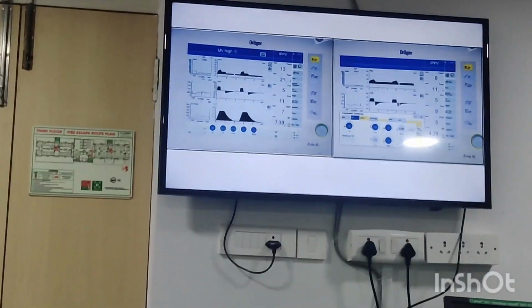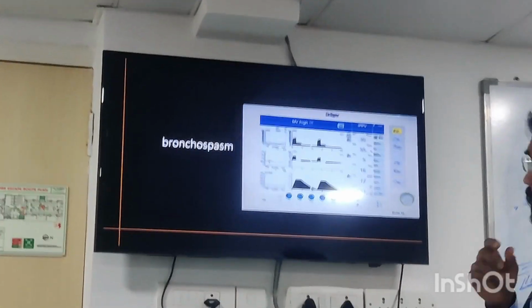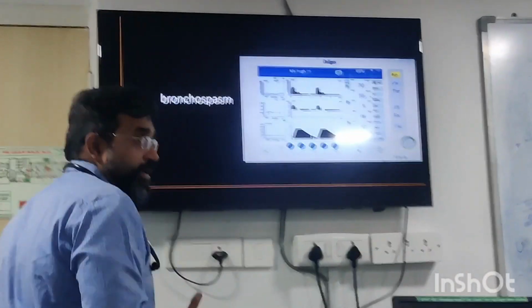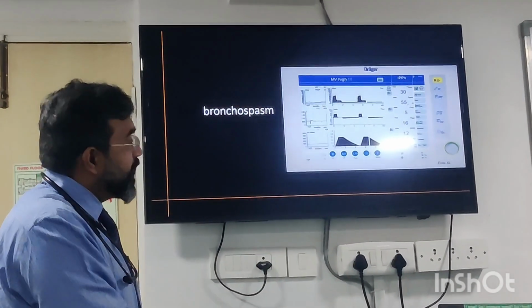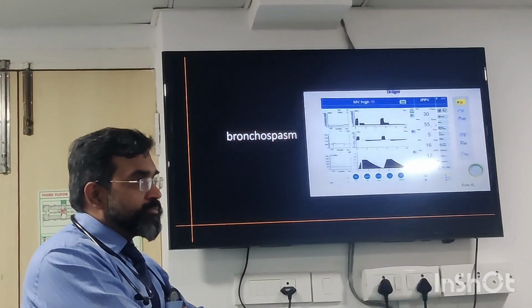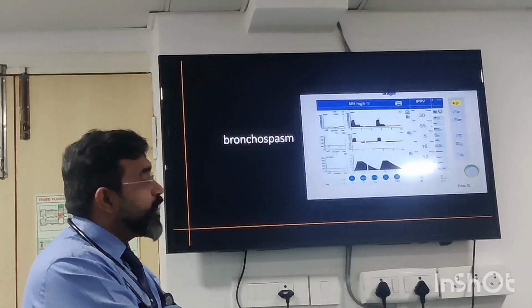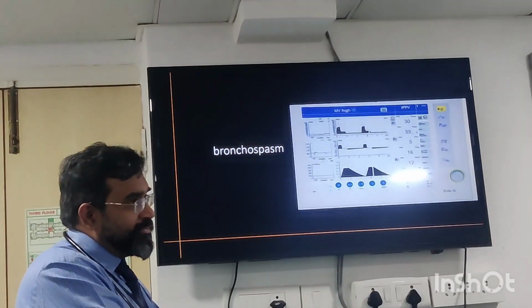So if I were to plot it, what happens in bronchospasm? Now see, what is happening in bronchospasm? Okay, this is the same patient. This is bronchospasm. What is occurring here? Can you tell me what is occurring here? Flow is prolonged. Yeah. So what you're seeing, first, no, you have to look at everything. What is happening?